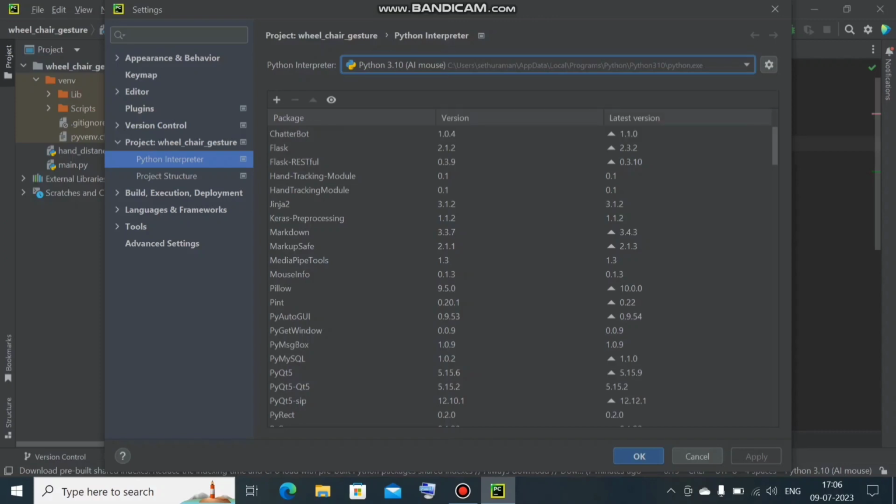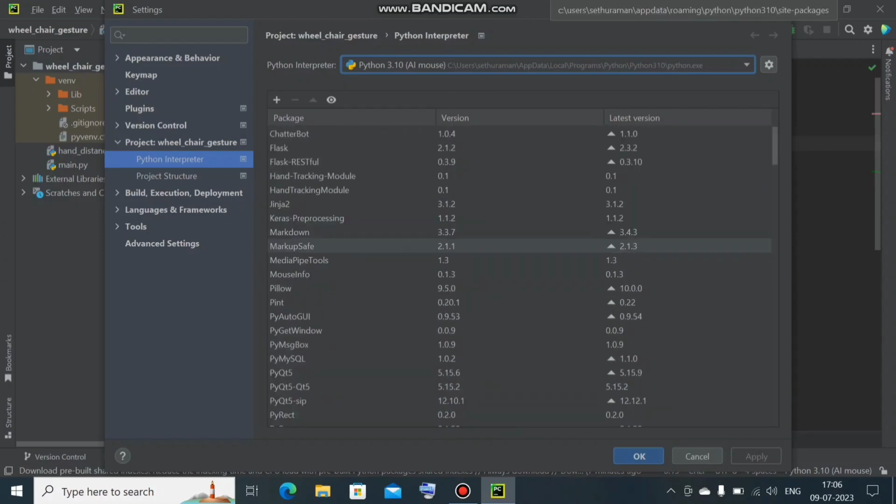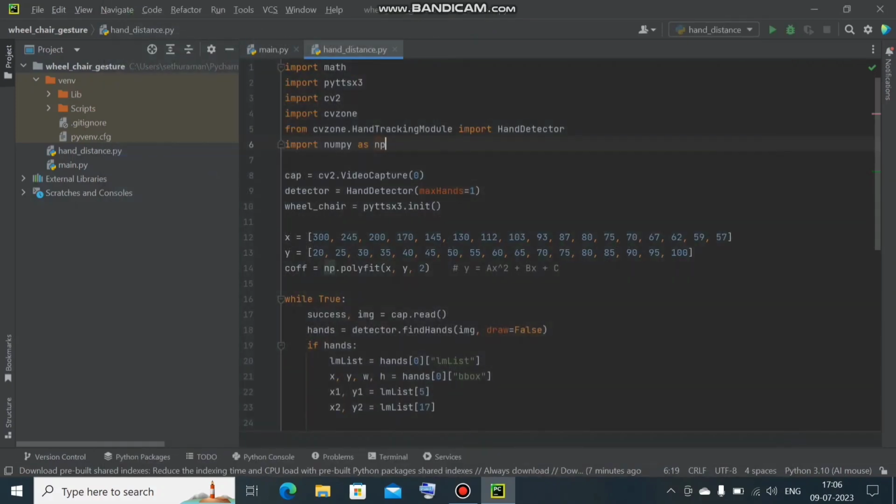I am using Python version 3.10. I use this interpreter for every project, so it has many packages. In this project, I will provide you one requirements.txt file. You can download that. You need the OpenCV, CVZone, and MediaPipe packages to work on this project.